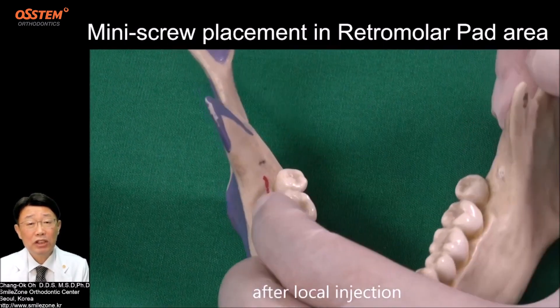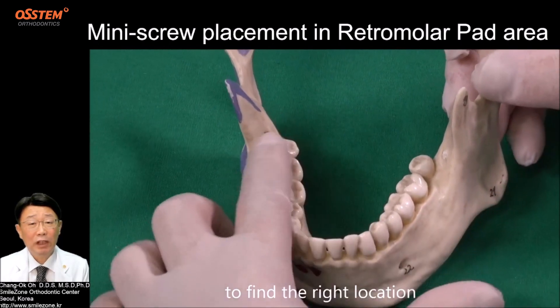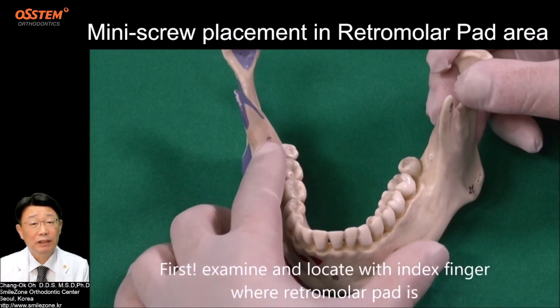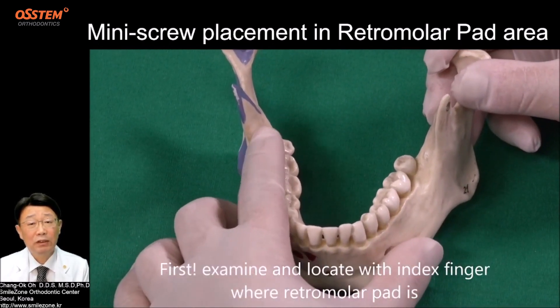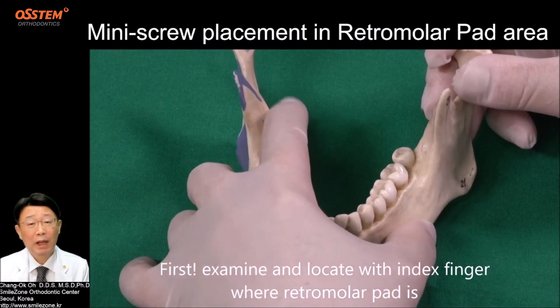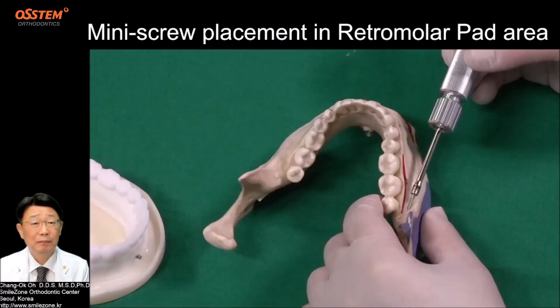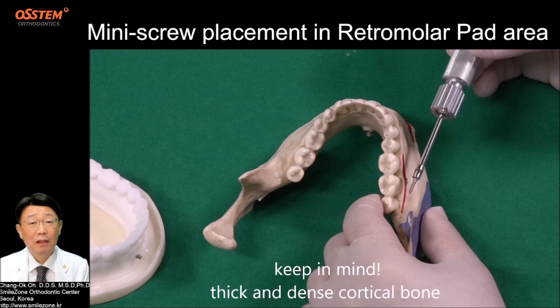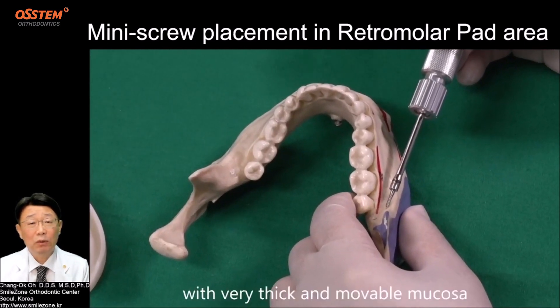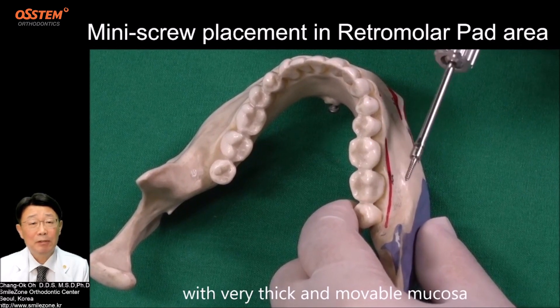After local injection, to find the right location, first examine and locate with your index finger where the Retromolar Pad is. Keep in mind: thick and dense cortical bone with very thick and movable mucosa.